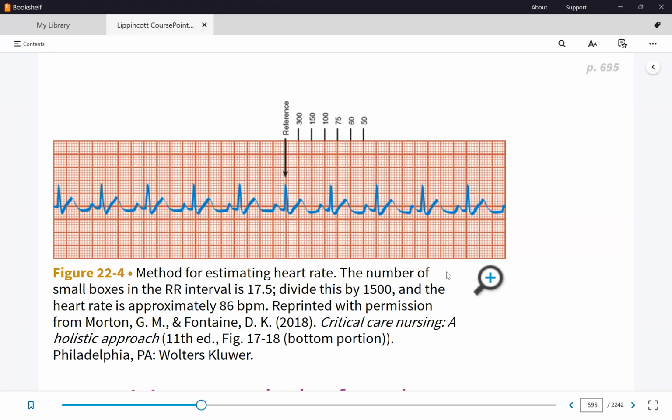So is it the same? About the same, yeah? So you can use this method, any of the 3 methods we used. We may have counted the marker earlier wrong because our QRS was different, right? We did 70, so we must have counted it wrong. The number will be the same. So yeah, we made a mistake. We'll repeat again.